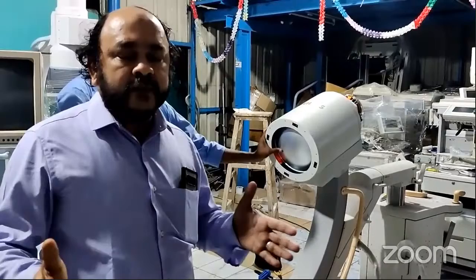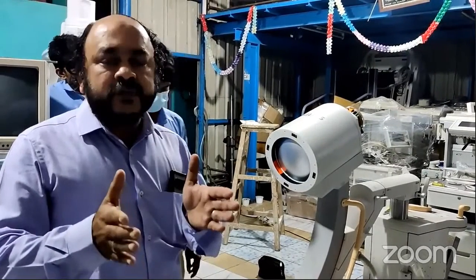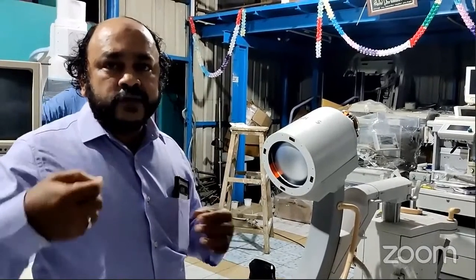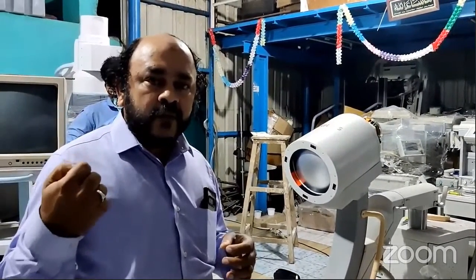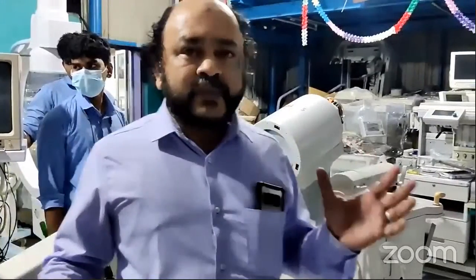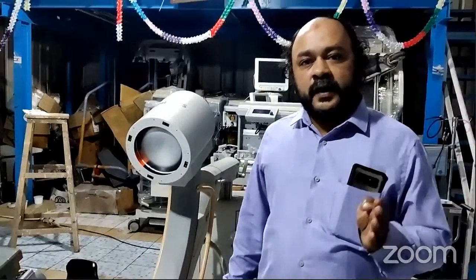They will specify the wall thickness should be like this. After the wall, you have to put some lead glass and lead tubing. All that is decided by the AERB. Once you get the equipment, you have to apply to the AERB through the hospital. The AERB will inspect and certify whether your C-arm or your X-ray system is in safe conditions, because it should not harm other patients.